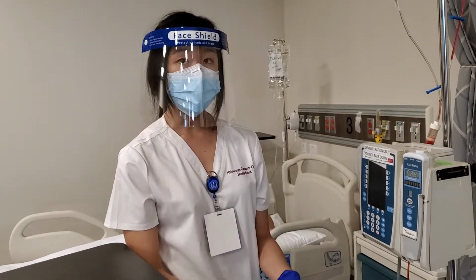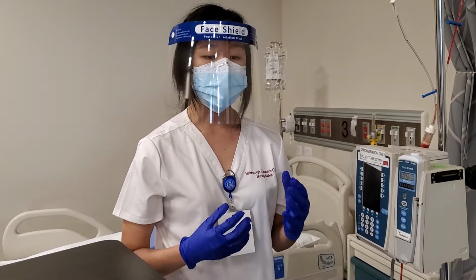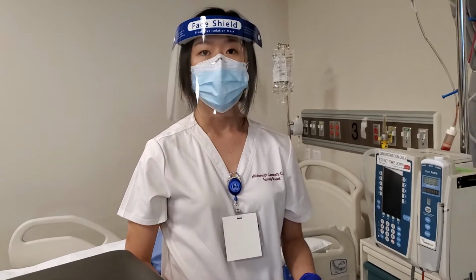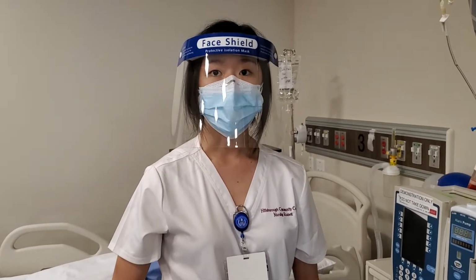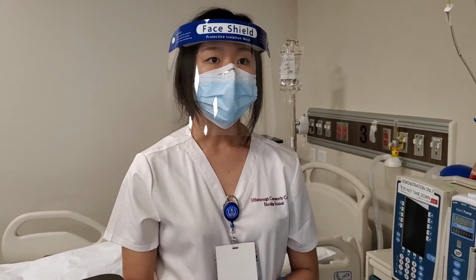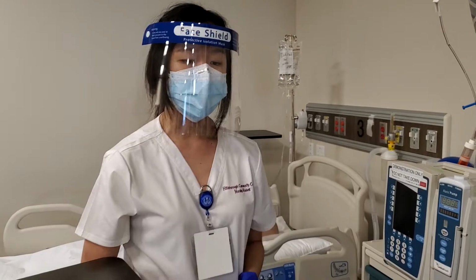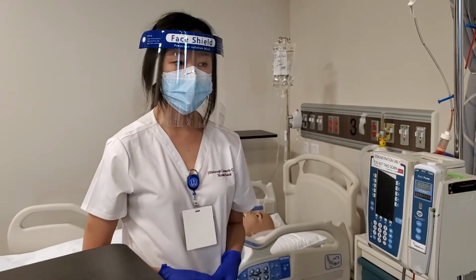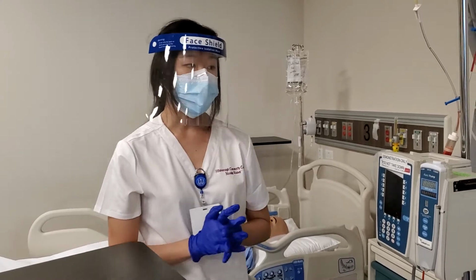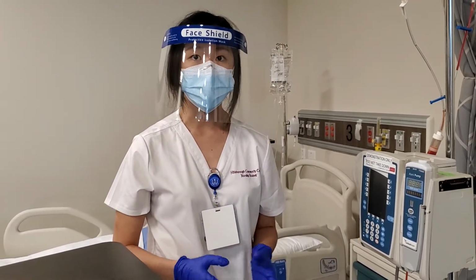And then after we start infusing, it's good to tell the patient to be aware of any signs of an infusion reaction, such as dizziness, nausea, lower back pain, flank pain, or any other signs such as like fever that could indicate an infusion reaction. And then we are going to monitor the patient every 15 to 30 minutes to see how they're going to take the reaction.